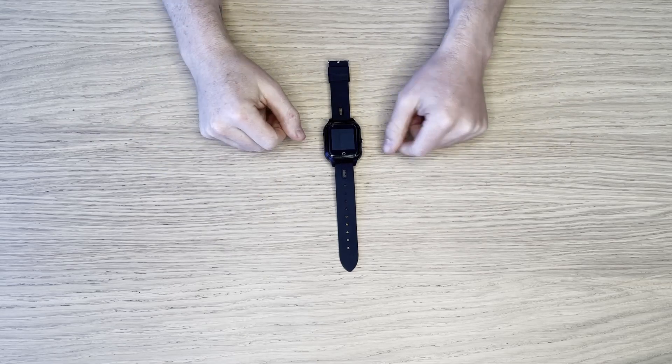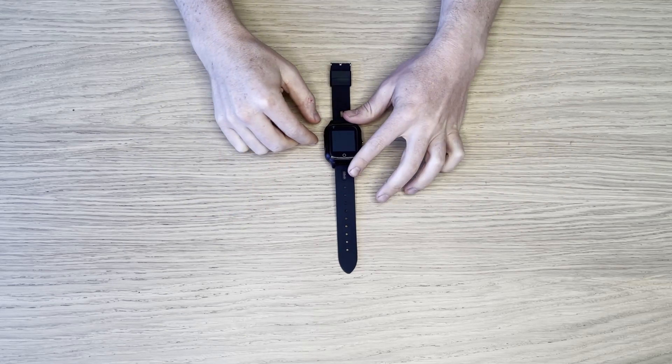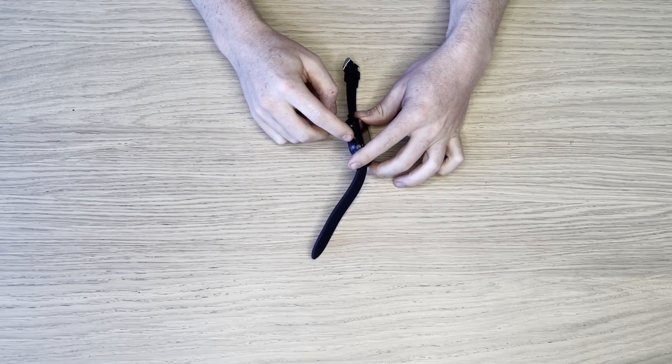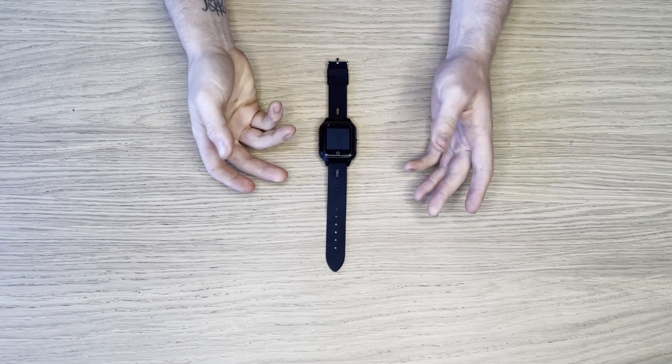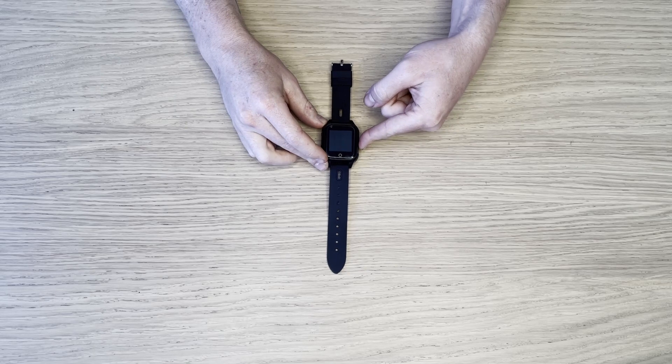To turn the watch on, the first thing you need to do is remove these two screws, put your SIM card in as per the instructions, and then do a long hold on the side button.